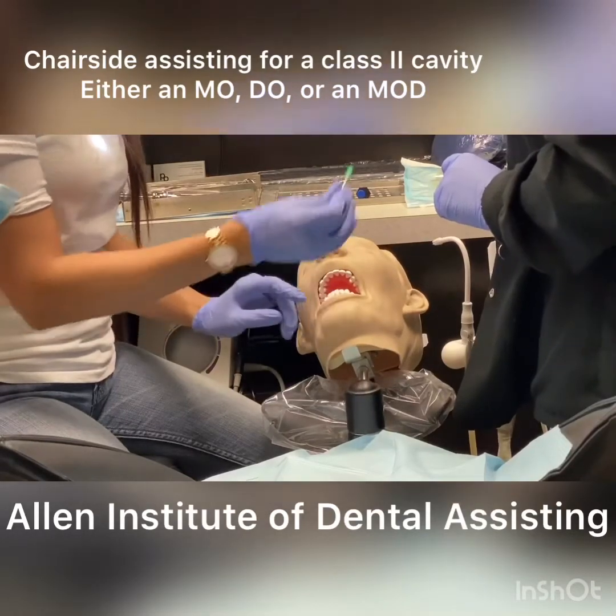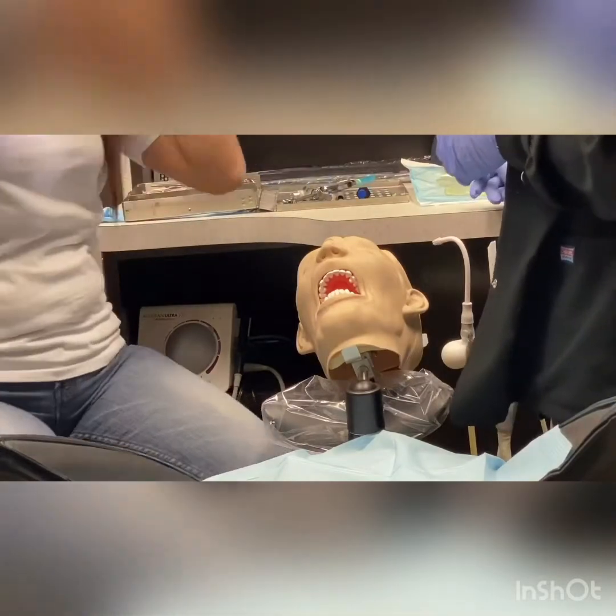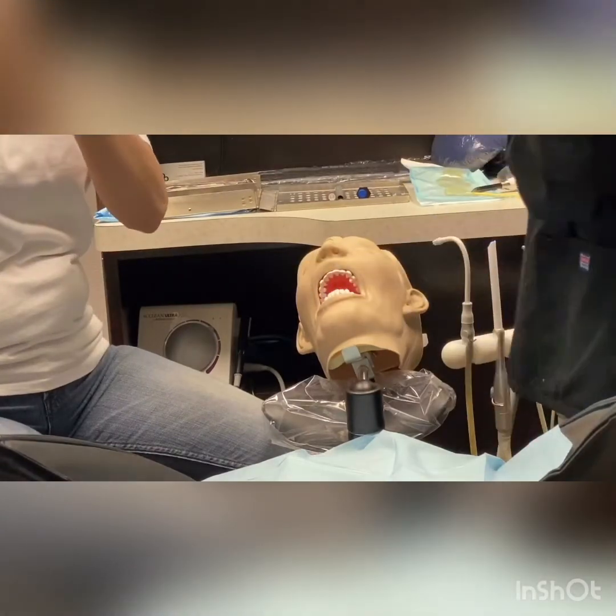We put topical right over here, and then you go in and add a little lidocaine or septocaine. But in this case, we're not going to pass it like such — she would take it and then she would do the injection.